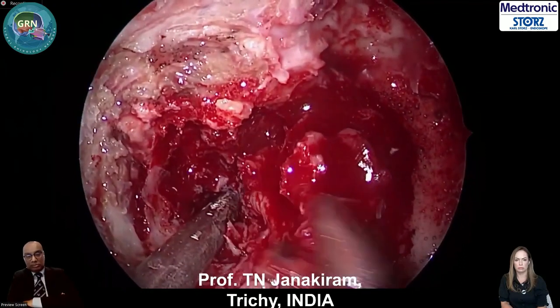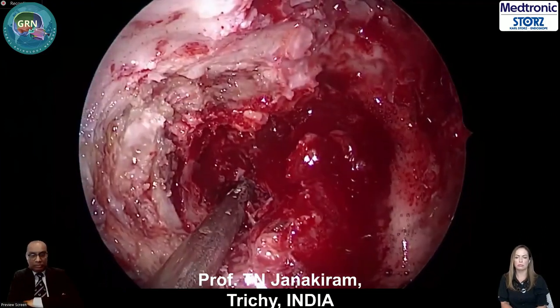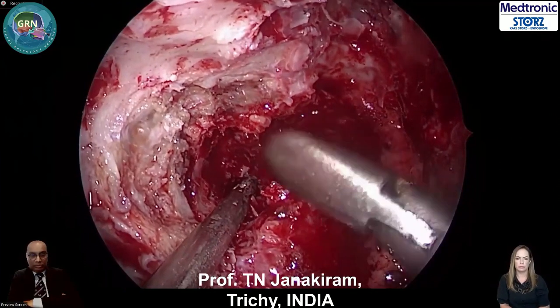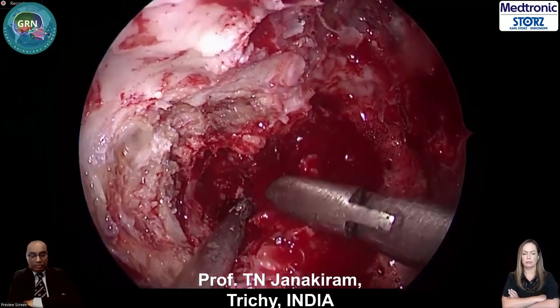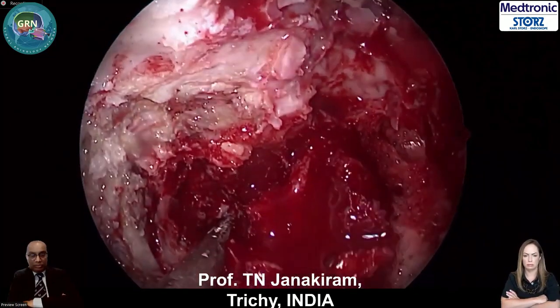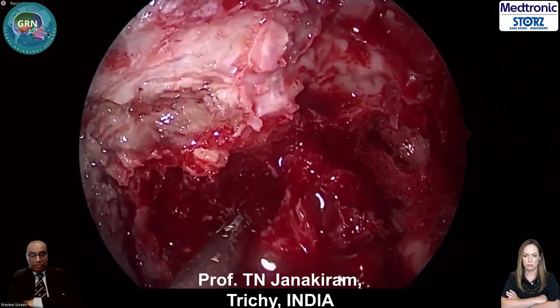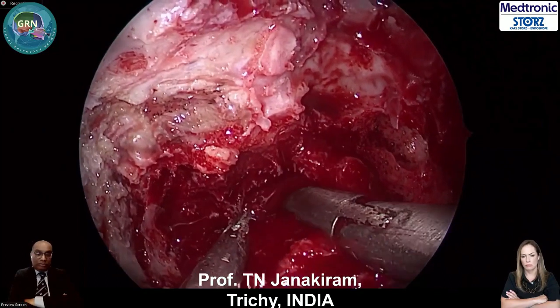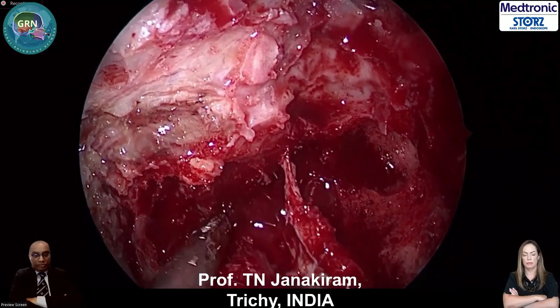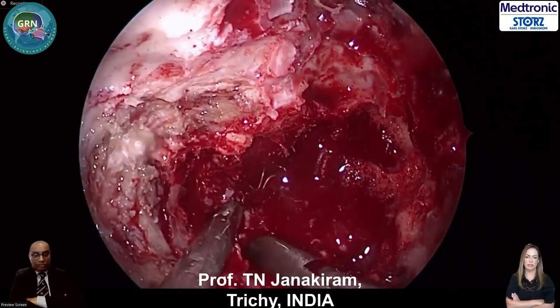Yeah. Now give me a Takahashi now. Can you see how you see the pulsation of the tumor there? Yes. See, this is what is called the gentle pull. So don't hold it. See that? Now I'm just bringing the tumor down. This is called the rolling down maneuver. From the sphenoid sinus, you roll it down. See how beautifully it's coming out of all the crevices. That's it. It's peeling off nicely.